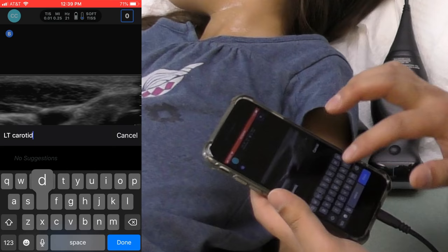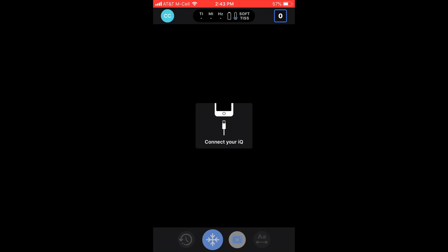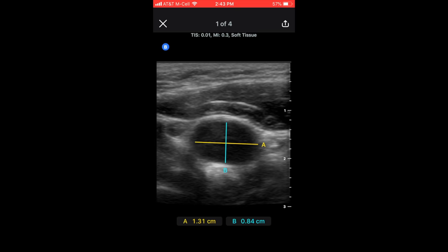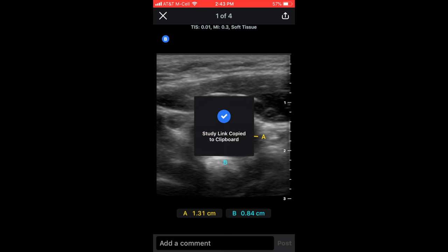Once the examination is completed, the app can be closed and the device disconnected. Images can be texted or emailed to others by pasting a link after being de-identified. The Butterfly IQ cloud can also be accessed through a desktop computer.